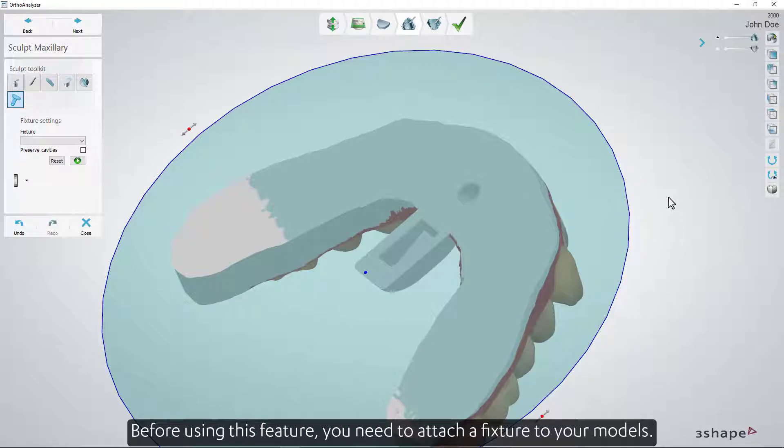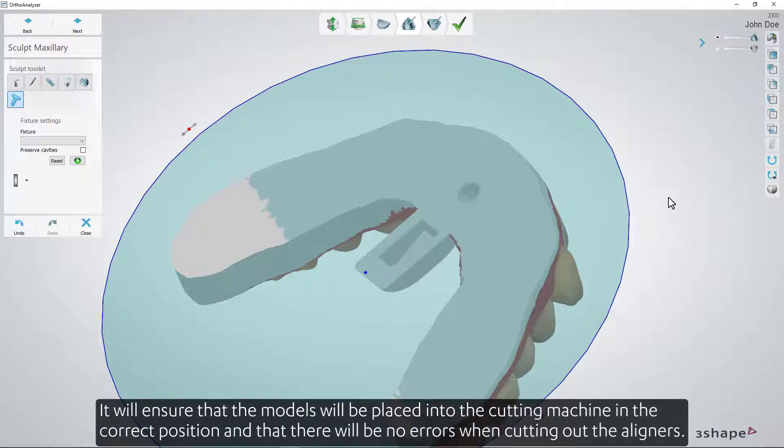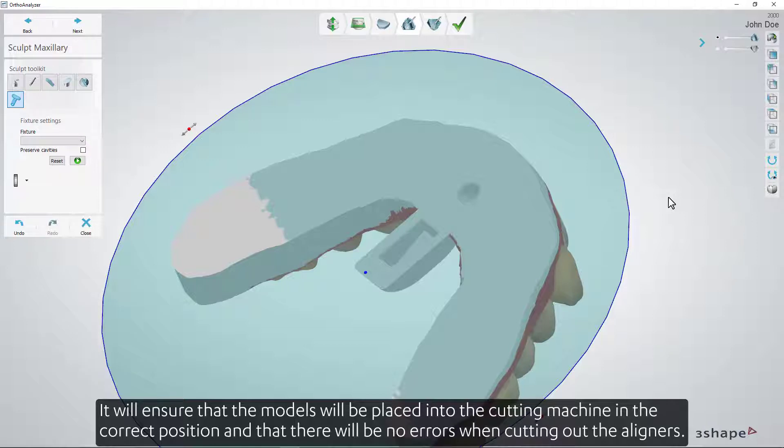Before using this feature, you need to attach a fixture to your models. It will ensure that the models will be placed into the cutting machine in the correct position, and that there will be no errors when cutting out the aligners.